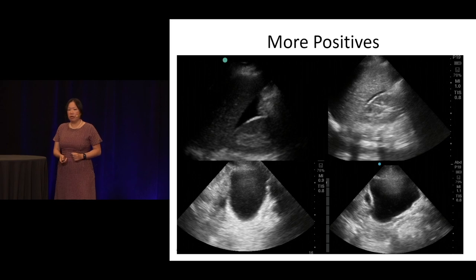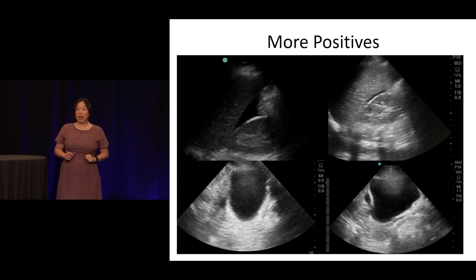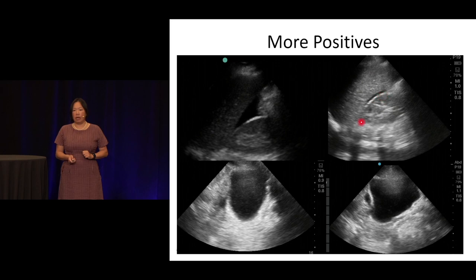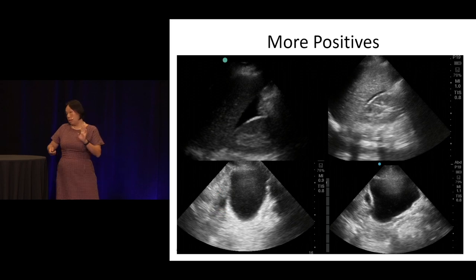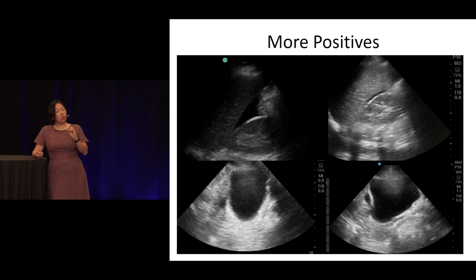Let's look at multiple positives. There is one positive spot per panel. Hepatorenal — liver, kidney — and here's the black space. Another hepatorenal black space. Bladder — there's that black space outside. Bladder — now there's space outside. Note that this shadowing from up top is an artifact — whereas you can see there's other tissue here, and all of a sudden that's black. Just because you see a black space doesn't automatically mean fluid — you want to fan through to make sure it's not just an iliac vessel, for example.